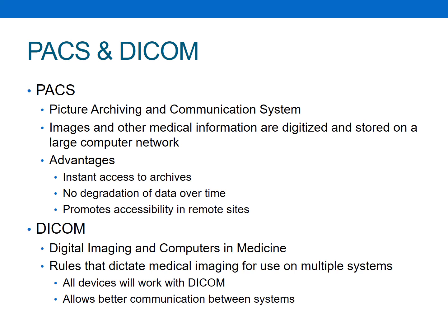So PACS stands for Picture, Archiving, and Communication System. Know that. And this is how the images and other medical information are going to be digitized and then stored on a large computer network. Most hospitals and clinics will have some sort of PACS administrator. They are responsible for making sure all of this runs very smoothly. There are times that the PACS system goes down and it causes quite the headache because we're no longer connected in between departments, and the radiologist can't see things, and it makes it very difficult to operate a radiology department. So the PACS for the radiology department is kind of the lifeline of it.